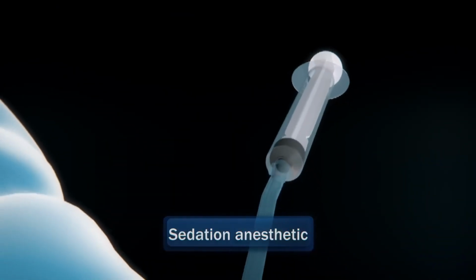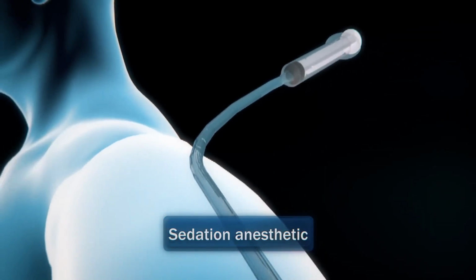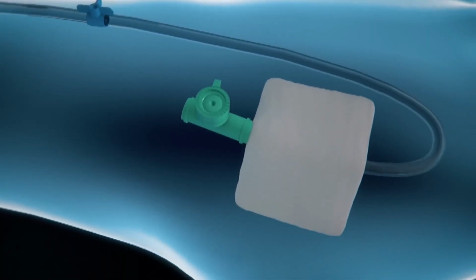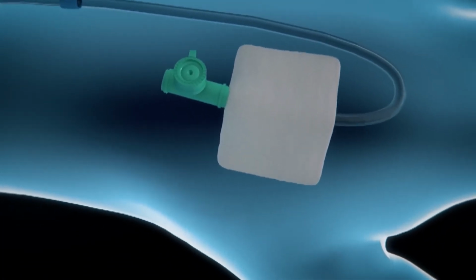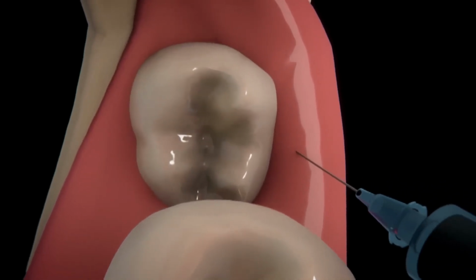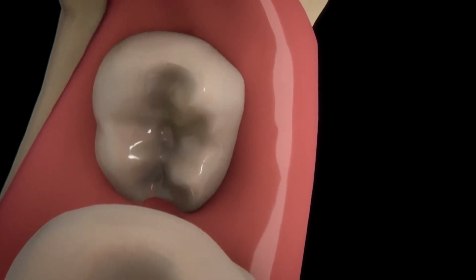If sedation anesthetic is applied, the dentist will administer anesthesia through an IV into your arm. Sedation inhibits the level of consciousness during the procedure, so the patient will not feel any pain and will have limited memory of the procedure. Here you will also be given local anesthesia to numb your gums.